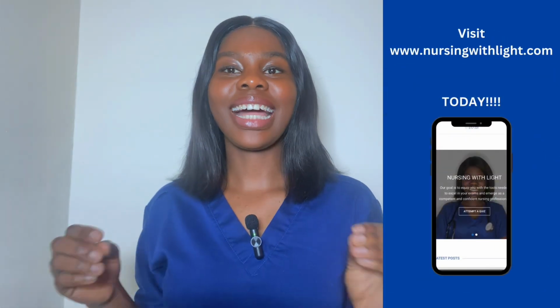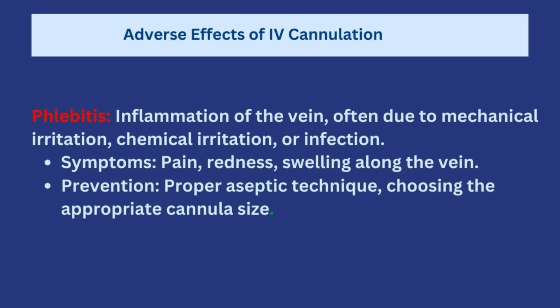Now let's talk about the adverse effects of intravenous cannulas. The first adverse effect of IV cannulation is phlebitis, which is the inflammation of the vein, and symptoms include pain, redness, and swelling along the vein that has been cannulated. And this can be prevented by ensuring that you use proper aseptic techniques when you're inserting the cannula and choosing the appropriate cannula size for the patient and the therapy.